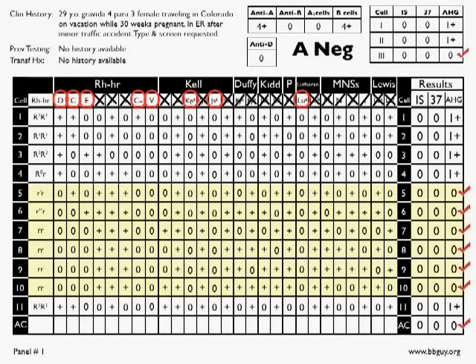Okay, so the great news is that, as we talked about in the last podcast, if you look at CW and V and KPA and JSA and Lutheran A, just about every panel you do, you're not going to be able to rule those out because those antigens are really not present on most panels. Yeah, there's one CW in cell one, but otherwise these antigens aren't even represented. So for the most part, you can just, at least in your brain, say, you know what, I'm not going to focus on them. Those really aren't important to me.